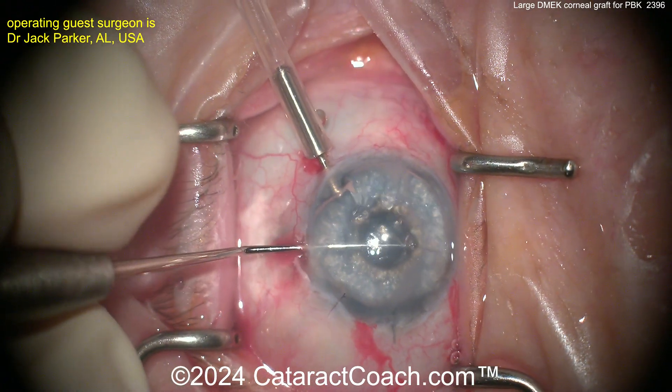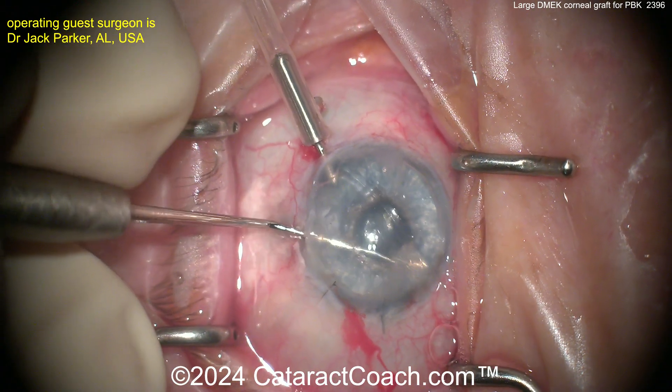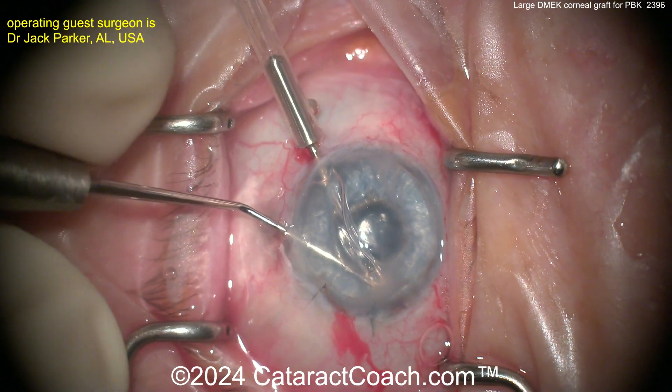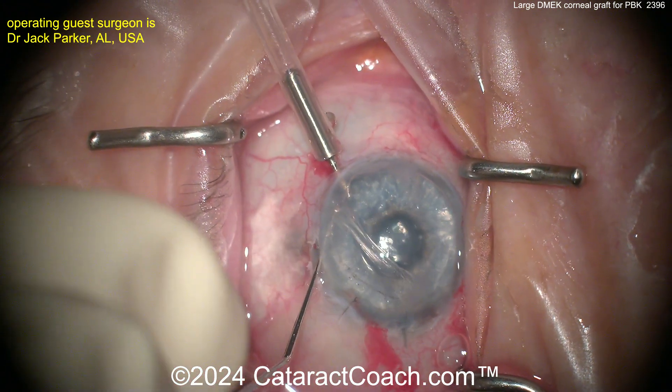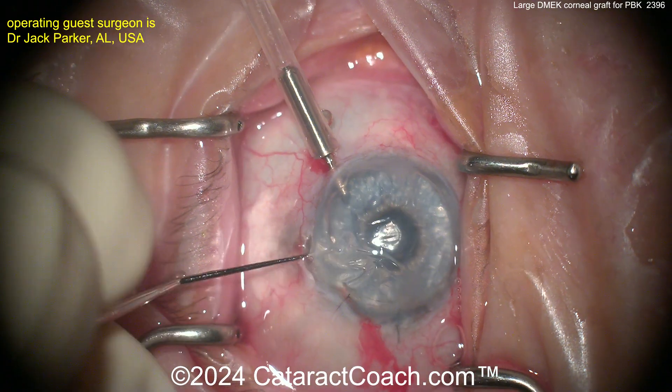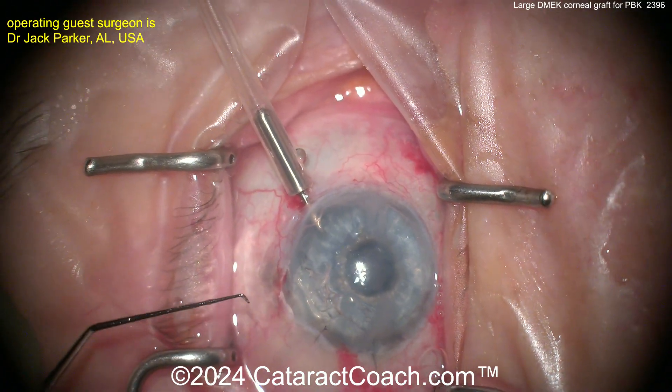Now, the larger the graft, the more challenging it is. So here carefully peeling this off — there it is, nice and easy. It looks like the AC maintainer has air going in — air going in that AC maintainer. And it's nice and easy getting this graft all the way around, beautifully done.